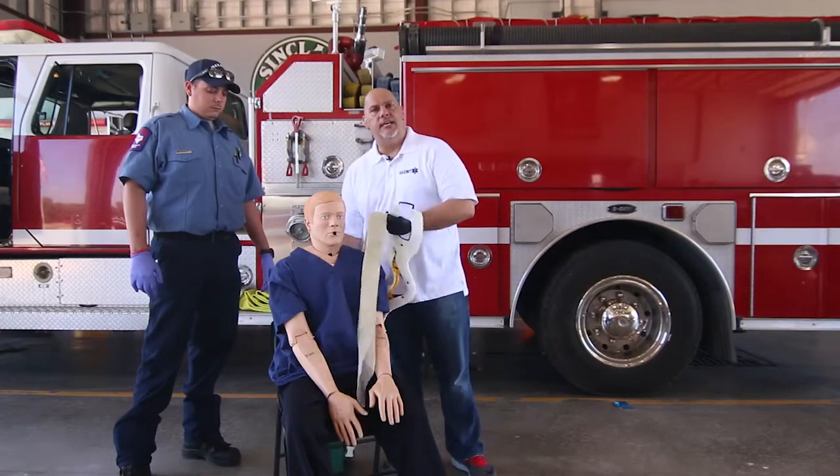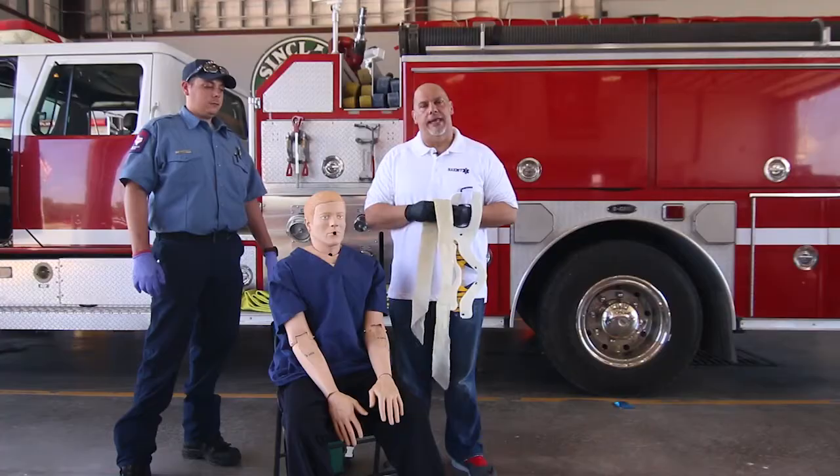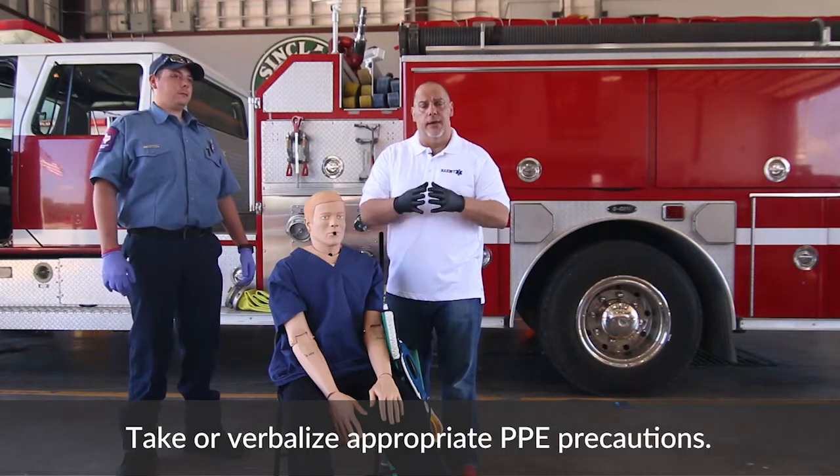Another thing that we'll need is something to secure the KED to the head — we're going to be using a triangular bandage. And of course, as you come into the skill station, you always want to have your personal protective equipment.